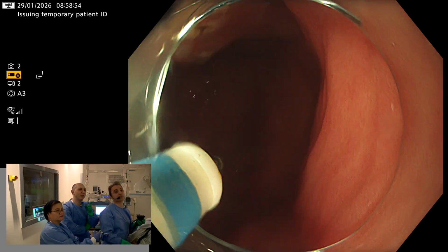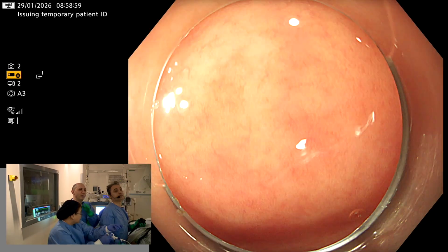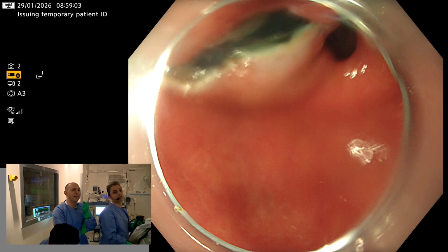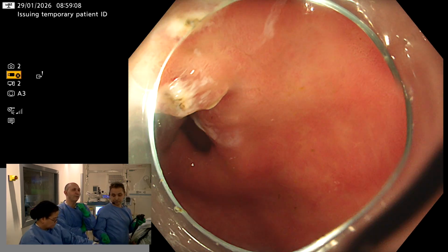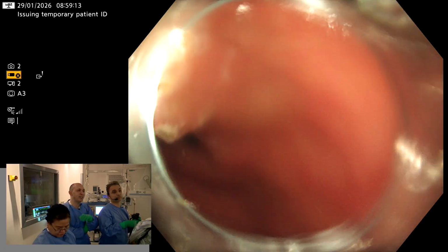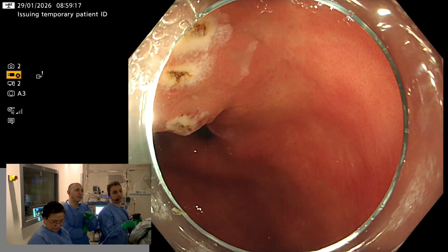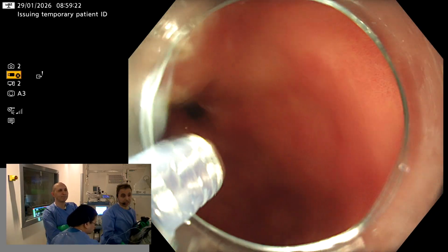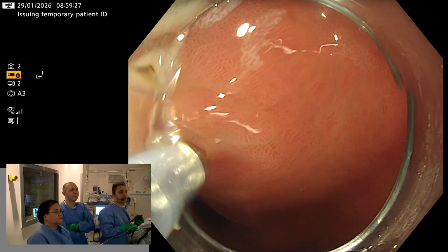As you see also, the muscularis mucosa is retracting the region in the stomach. When you make the incision, the muscularis mucosa will retract the lesion away from the edge. So it's getting smaller or shrunken from the central part. And this is, of course, one of the methods of physiological retraction to facilitate going to the submucosal space. Because for the gastric ESD, the gravity will not help us like in colonic by changing position. So the best way is to make a strategy-based procedure.